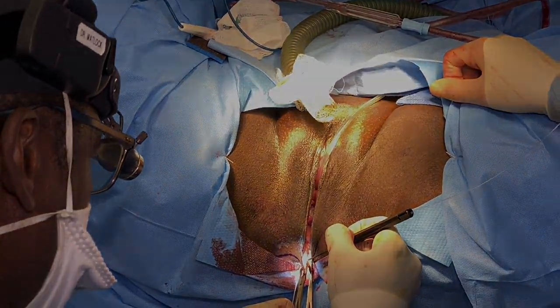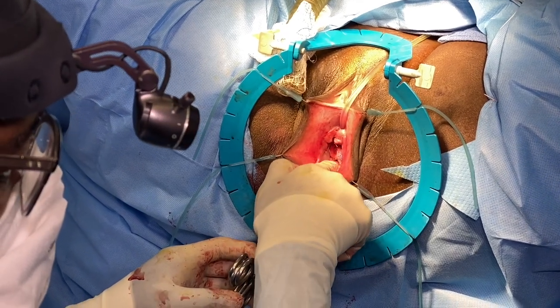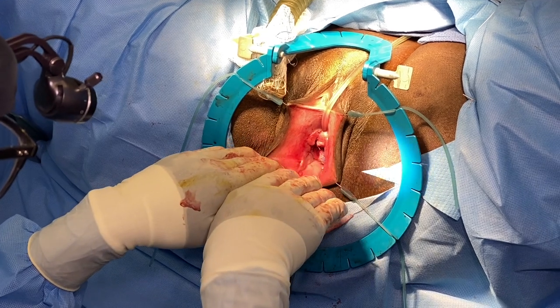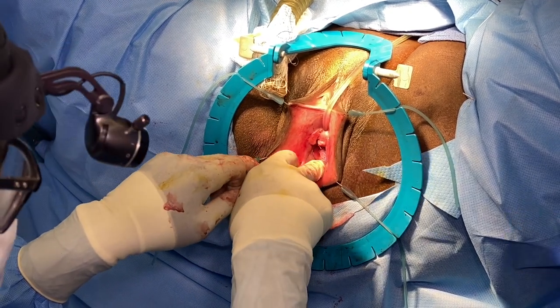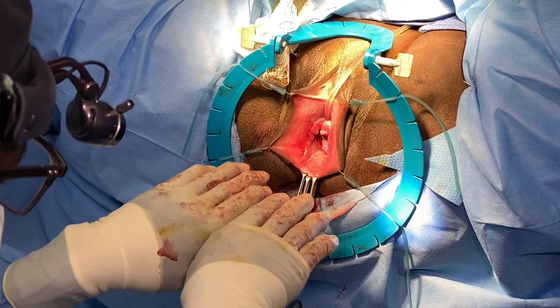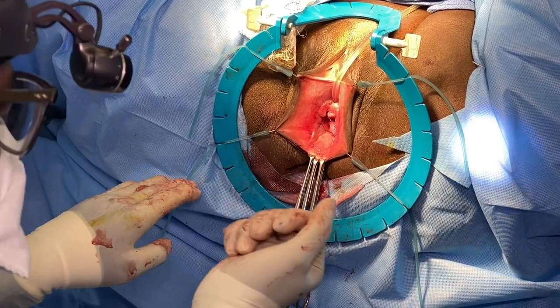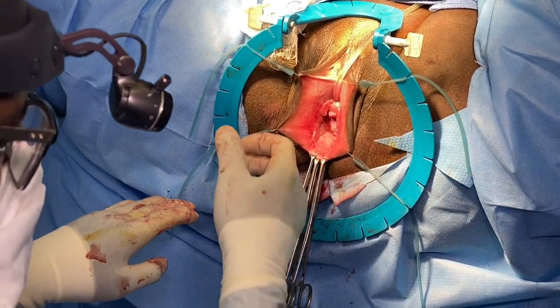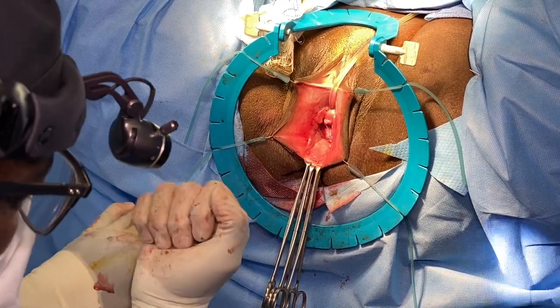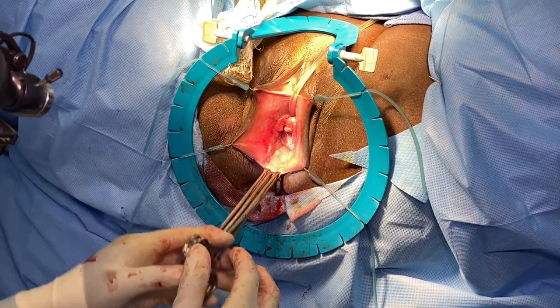We'll bring you back in. Open it up now so that we can work on the posterior floor. We're going to deal with this rectocele. Rectocele just means that the muscles of the posterior wall, or floor, they're pulled apart. These are the muscles, they're pulled apart, and even the rectum is pushing up. Some women even say they have to push down here so they can have a bowel movement because the direction of the bowel is trying to move and it's coming up instead of out. We've opened up here the perineum, we removed the skin, okay?